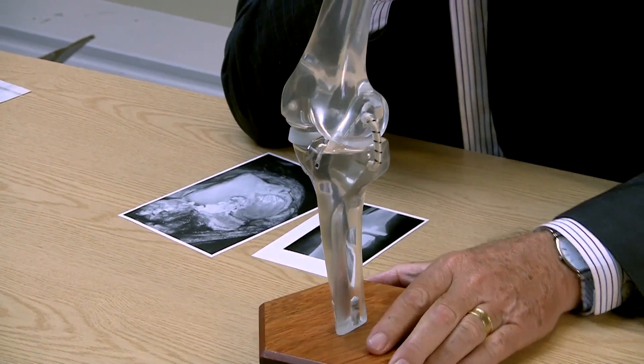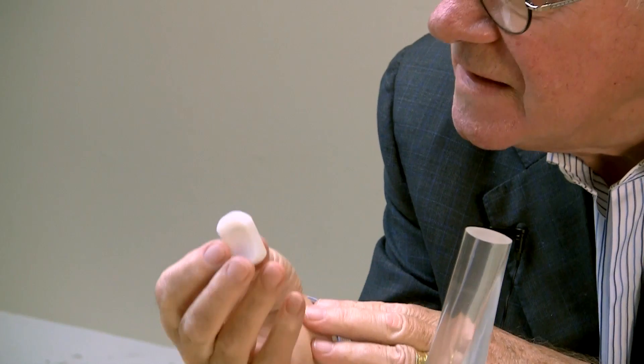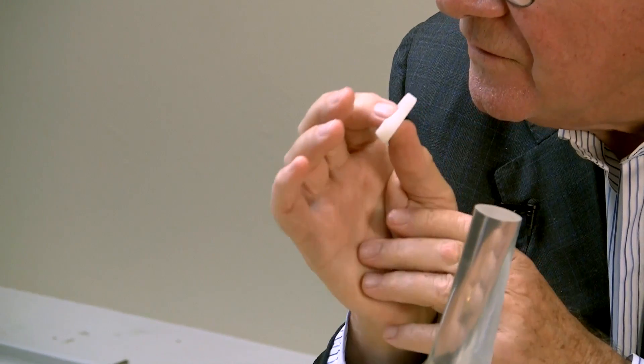And the result of those thoughts are embodied in this little model. This is a model of the left knee of a human being, and it contains on the inside, in the inside compartment, an Oxford knee prosthesis. The essence of this invention was that the device contains a mobile meniscal bearing, which acts much the same way as the menisci of the natural knee.